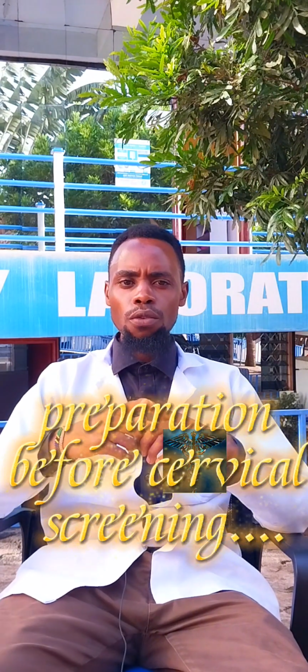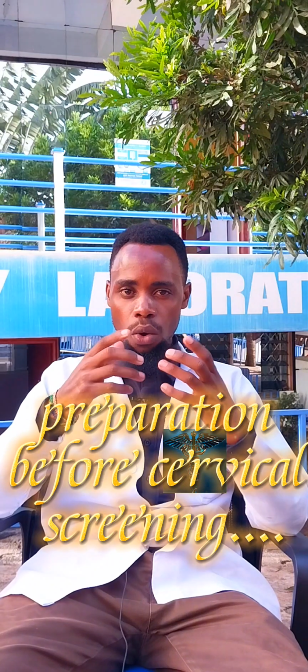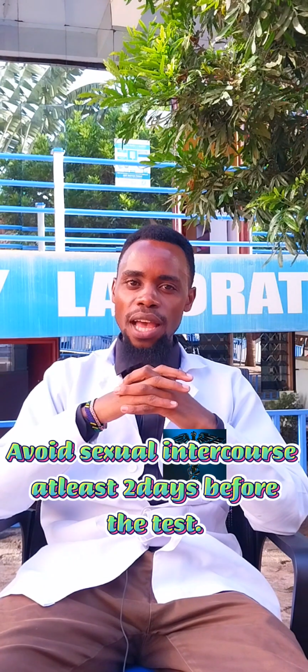Before we remove the specimen from your cervix, you need to prepare. Kuna zile preparation methods ambazo unafaa ukuwe aware before that specimen is taken. Number one, you are required to avoid or abstain from sexual intercourse at least 2 days before the test. Usikuwe na mechi, don't schedule mechi at least 2 days to the test. Sawa. Number 2, avoid using what we call vaginal medication.